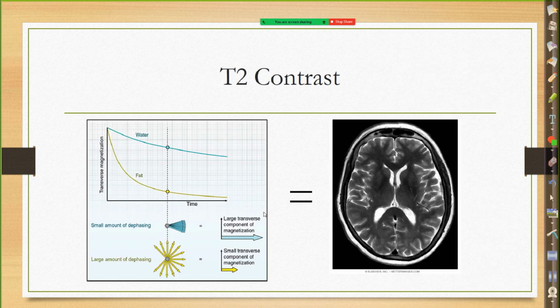So that's what happens. There's a kind of a big issue with this, because can you find the subcutaneous fat? It's right here. It's still bright. So this is where it confuses some students. The reason it's still bright is a concept we'll learn a little bit later on. It's called J coupling, where we apply repeated RF pulses, and it bumps up the signal from fat with that particular pulse sequence. It's called a fast spin echo pulse sequence. So most T2 weighted images are fast spin echo pulse sequences.